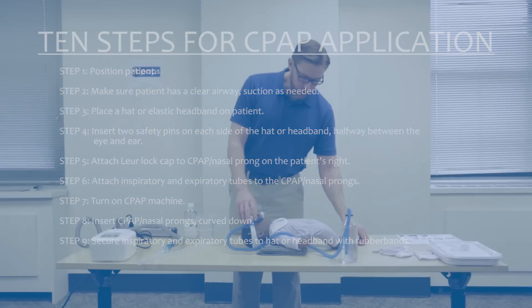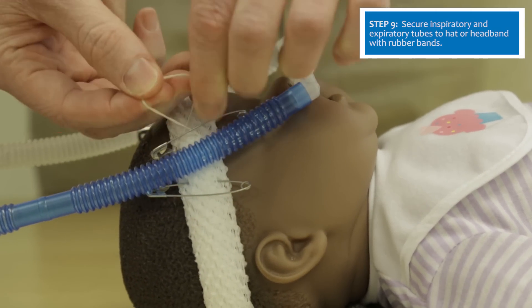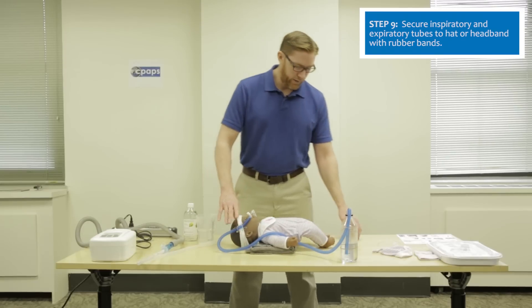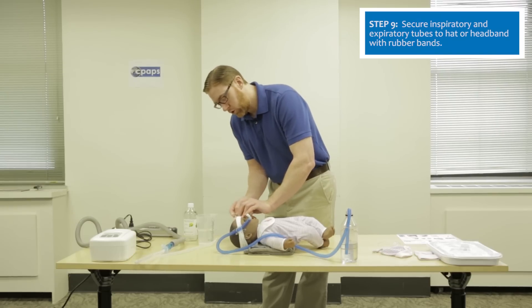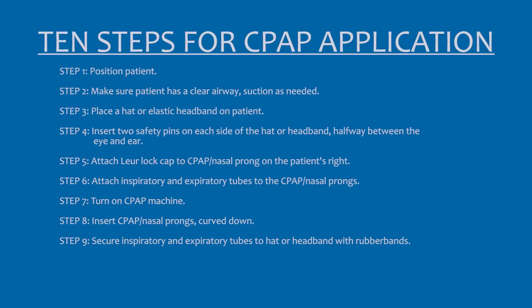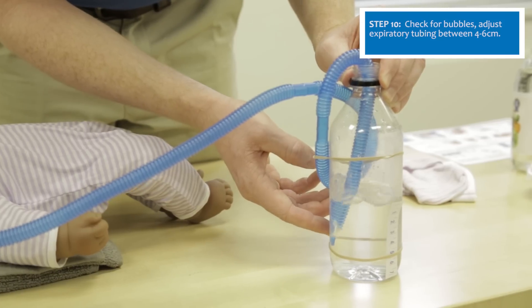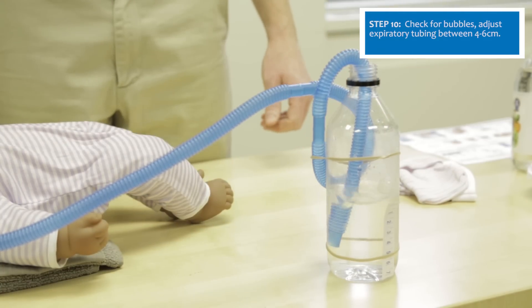Secure the CPAP prongs by using a rubber band looped around the safety pins on both sides. If the patient is moving or squirming, have a parent or another healthcare provider help hold the patient or hold the prongs in place while you secure them. Check the water bottle to confirm nice bubbles with the expiratory tubing at five centimeters, which ensures the circuit is closed and the patient is receiving five centimeters of CPAP.